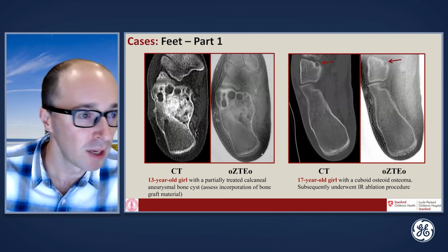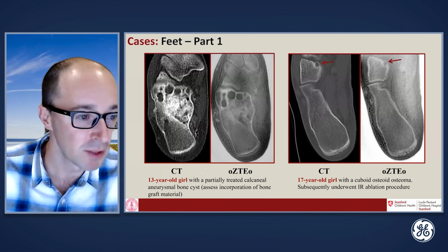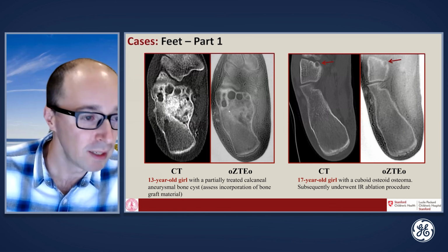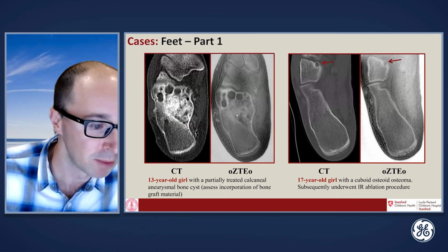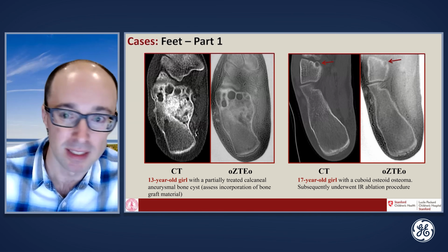Moving on to a couple of cases in the feet. This is a 13-year-old girl with a partially treated calcaneal aneurysmal bone cyst, which we have been acquiring images on to follow up bone incorporation and graft material. So I only showed one time frame here, but we can see that there's incorporation of bone graft material. And then comparable imaging on the CT.